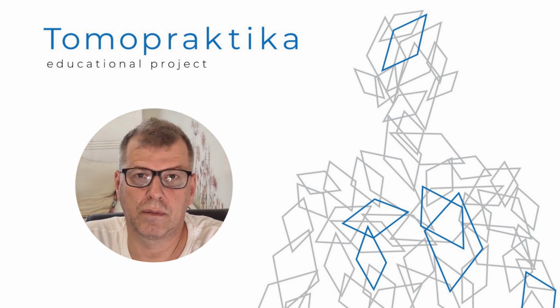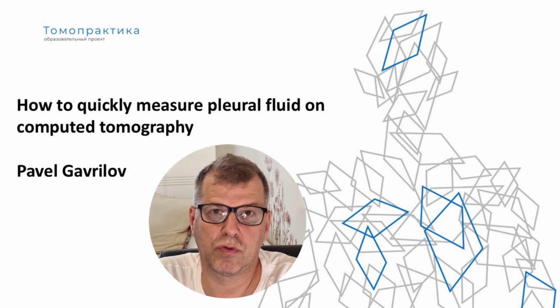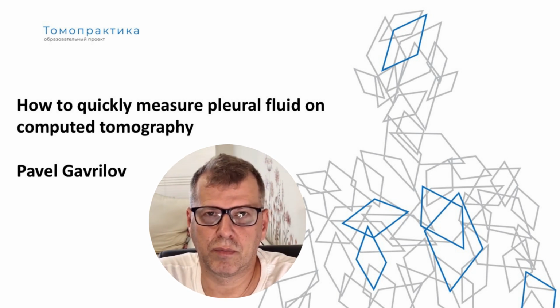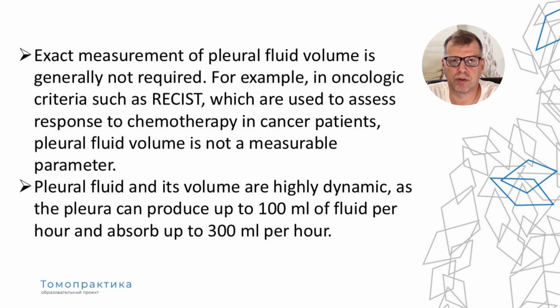Let's get started. Today I'd like to talk with you about something practical, how to measure pleural fluid volume on CT. It's a simple topic, but as you'll see, there are some useful tricks that can really help in daily practice. Now, let's be clear right from the beginning.